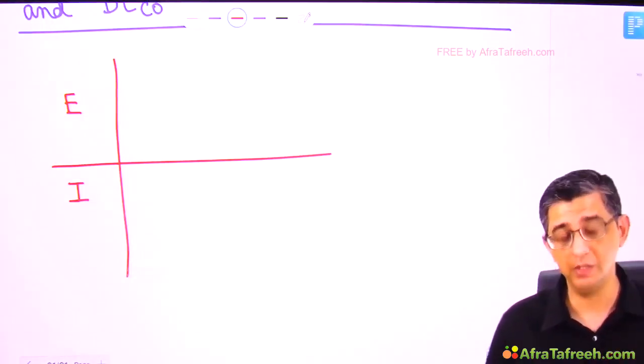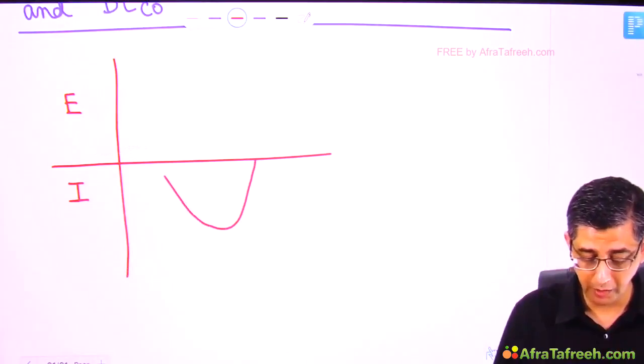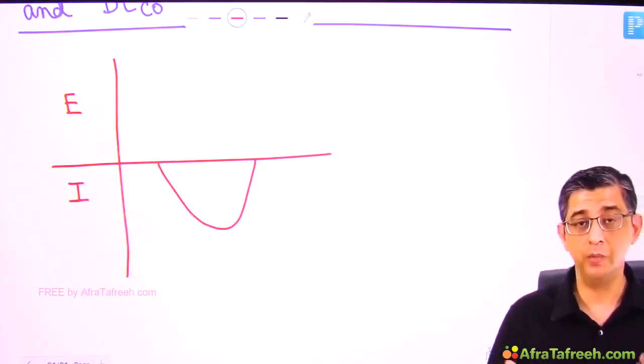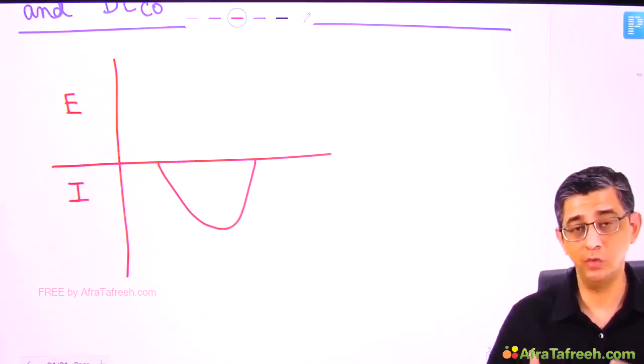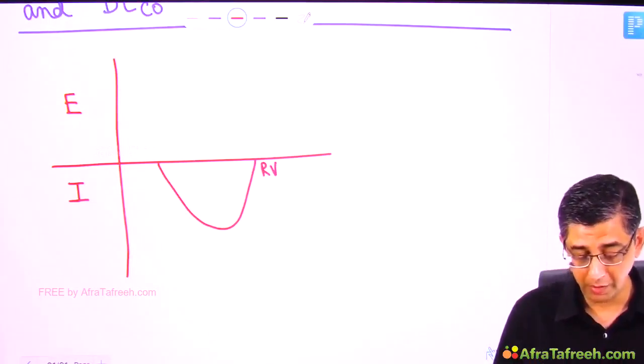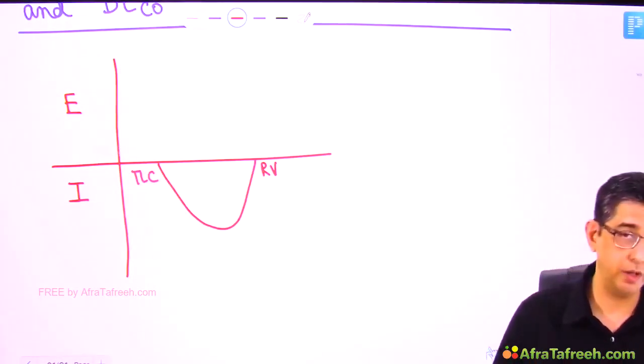So I'm going to ask my patient to do some practice breathing, and then when he breathes into the mouthpiece, this is the kind of recording that I will get when I instruct my patient to breathe in as hard as he can. My advice would be breathe in as much as you can using all the power of your chest muscles. And I'm noticing that my patient is going up by filling air in his lung, from residual volume to total lung capacity.